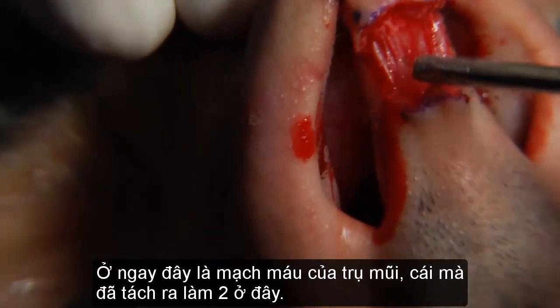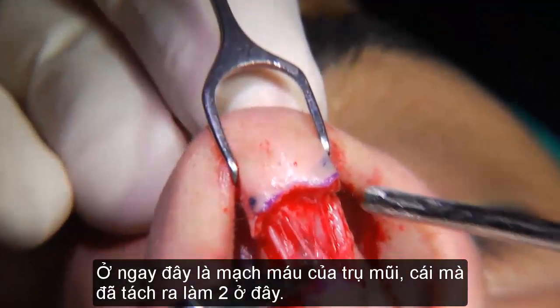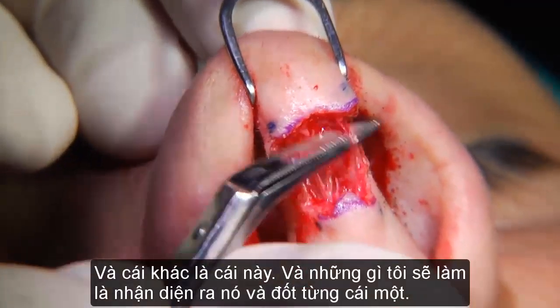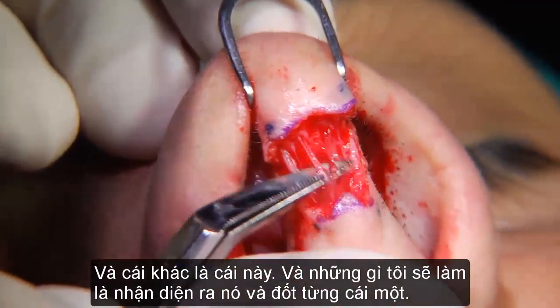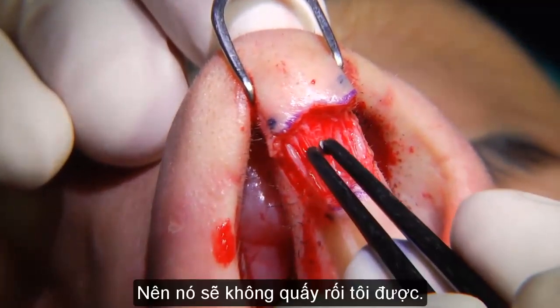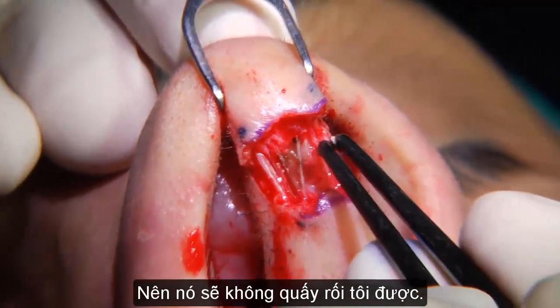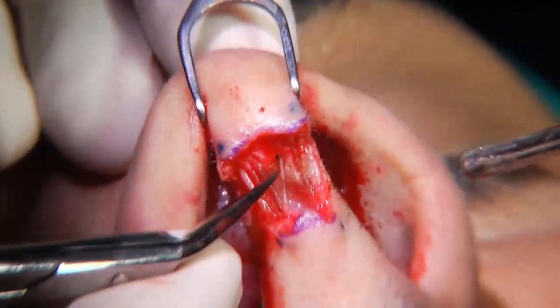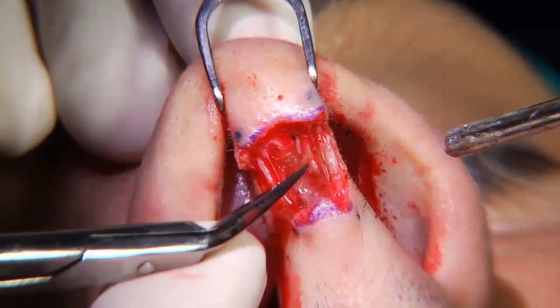See his columellar vessels. One has a bifurcation here, and the other one is this one. So one bifurcates. What I like to do is identify them and buzz them one by one so they don't really harass me.